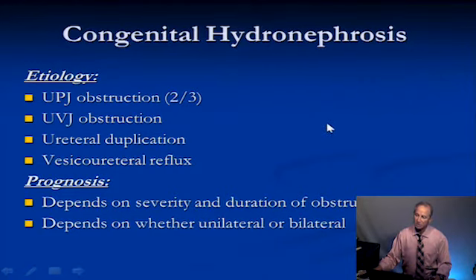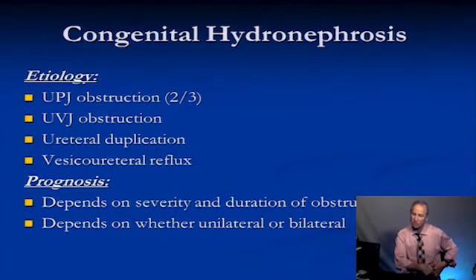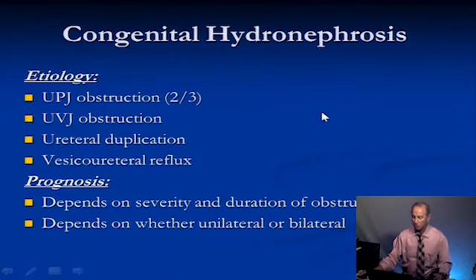Now, if the fluid around the baby starts to decrease to the extent of oligohydramnios because of the size of that kidney, I can drain that kidney. I can put a shunt in it, like what we do with the bladder. You can put a pigtail catheter, drain the kidney, and leave the catheter there until delivery. But most of the time the baby will pull it out. That drains the obstruction into the amniotic cavity, because you leave the shunt hanging from the baby's skin into the amniotic cavity, and that will drain the fluid there. Sometimes you can just go in with a needle and aspirate that kidney, and it might not happen again. But we try not to intervene as long as the amniotic fluid looks normal.